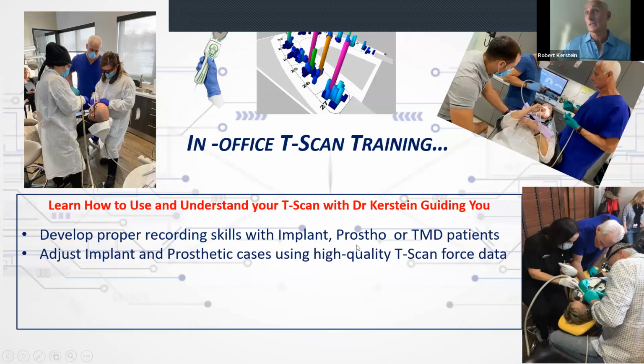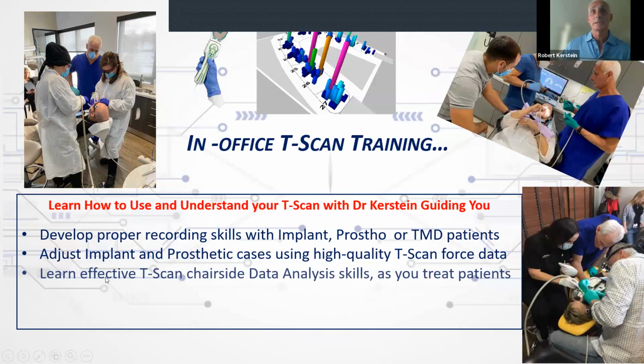And you learn to do adjustments with high quality TScan data guiding you. You actually learn how to record it, and then you learn how to fix the problems right then and there. Typically people bring in patients that are struggling with their new prosthesis, or they got their teeth capped and they don't like the way their bite feels. The patients are always amazed at how one session can really improve their bite comfort. So you learn how to effectively analyze TScan data at the chair, which is what you do when you treat patients. And my role is to guide you and help you through all of these steps.